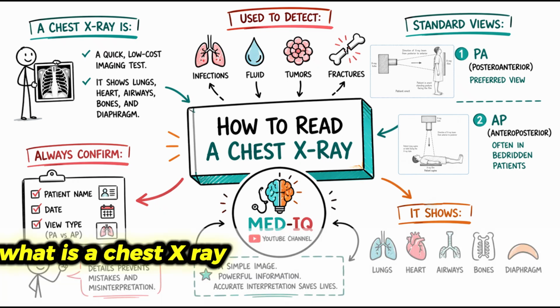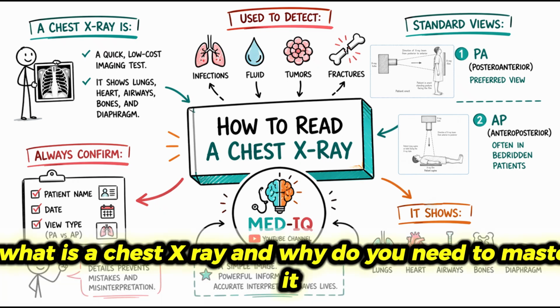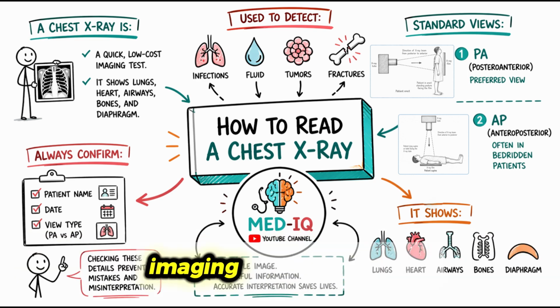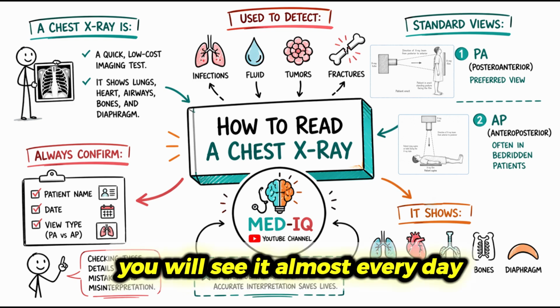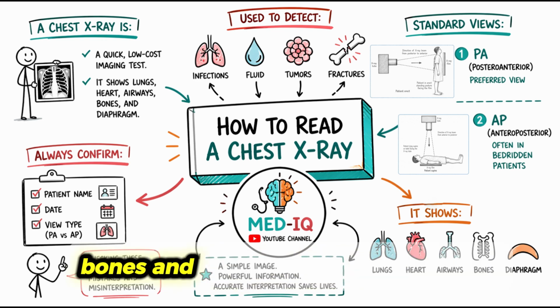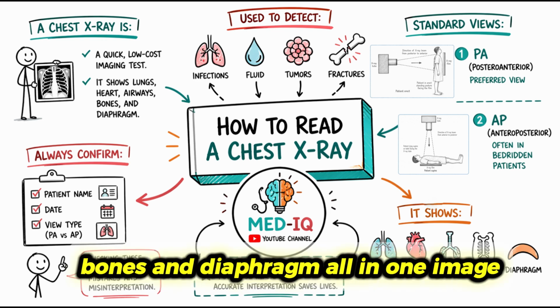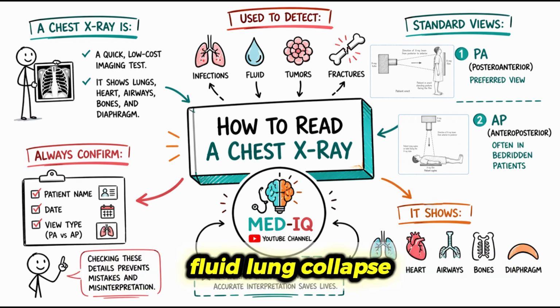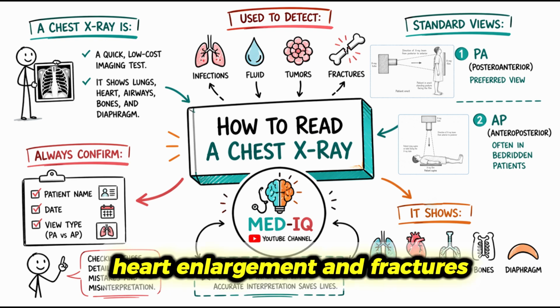What is a chest X-ray and why do you need to master it? A chest X-ray is one of the most commonly used imaging tests in medicine. You will see it almost every day. It gives you a quick view of the lungs, heart, airways, bones, and diaphragm all in one image. You use it to detect pneumonia, fluid, lung collapse, heart enlargement, and fractures.